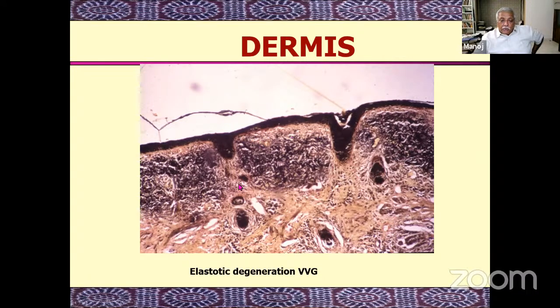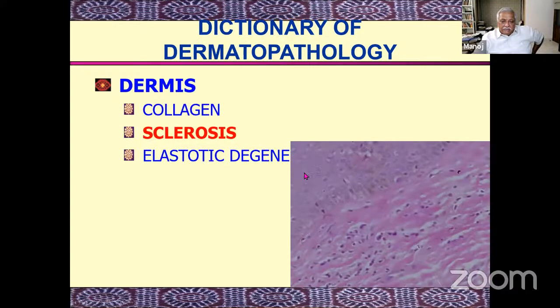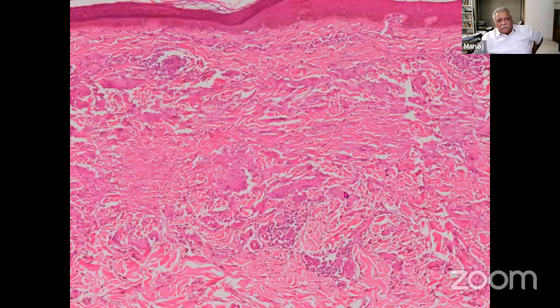Very glaring example of elastotic degeneration of the dermis, giving you these dense cushions of dead elastotic material. Sclerosis of the dermis has multiple reasons. We will discuss these in some of the subsequent sessions. One interesting degeneration of dermis you might like to keep in mind. What we saw just now was sclerosis, elastotic degeneration. So something else is happening here.